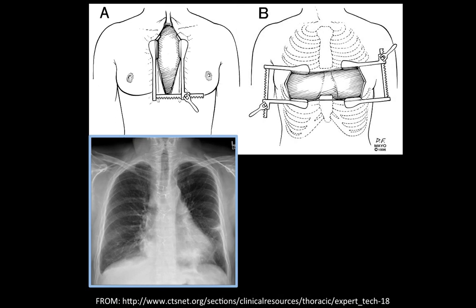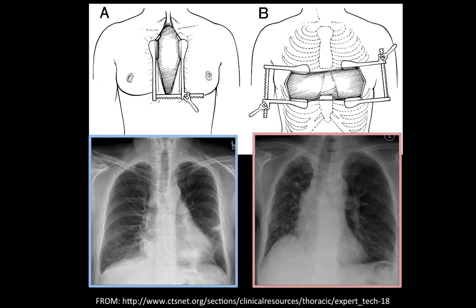Let's compare this to a horizontal incision. To close that you need vertically oriented wires, and this is what's called clamshell wires. This type of incision is a bit unusual and not that common, and when you see it you have to think about lung transplantation, because this is the usual incision for such a procedure.